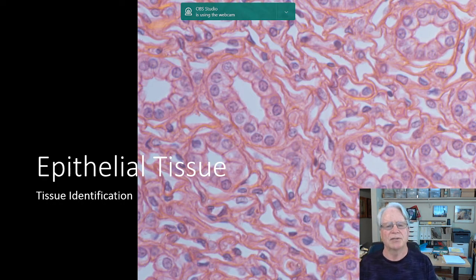Hello. This is a continuation of the first lecture in the series of lectures for the lab that I'm giving on tissue. And as you know, since you've looked at it already, the first presentation was about epithelial tissue. This presentation is designed to reinforce that presentation, except that we are going to have visuals instead of just me writing out notes. So this is a PowerPoint presentation, and as I go through it, we'll be talking about epithelial tissue visually.